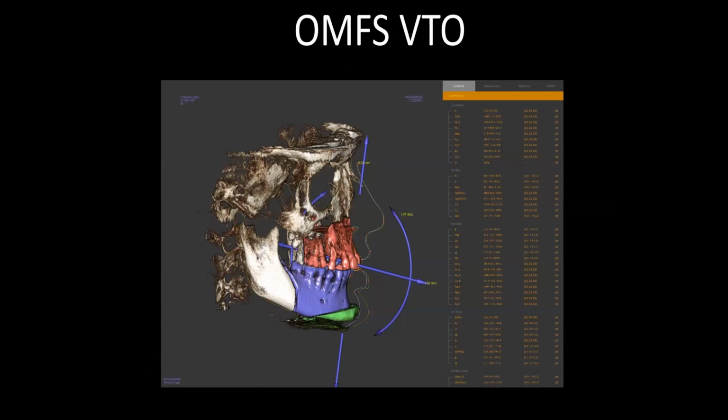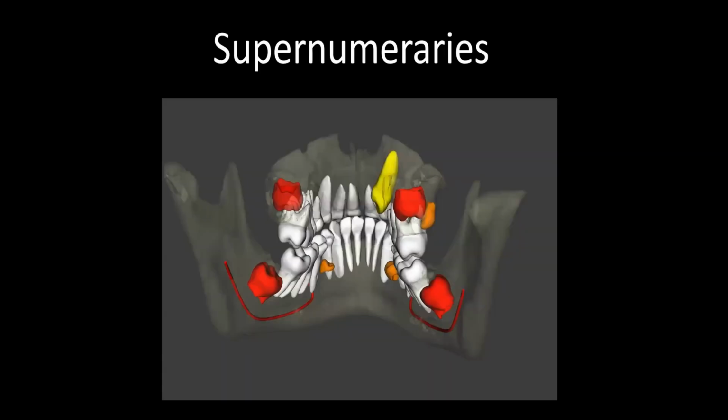With the in vivo model comes the cephalometric analysis, which I didn't really show you, but in the software, once you have this segmented, right, this would be part of the parent segmentation. It has features in there where you can play around with orthodontic movements and simulations, and you see the soft tissue change, and you see the soft tissue cephalometric values change to better normalize them.